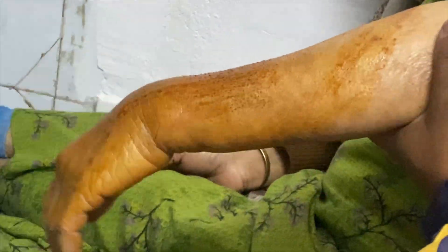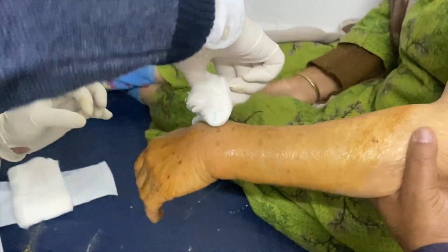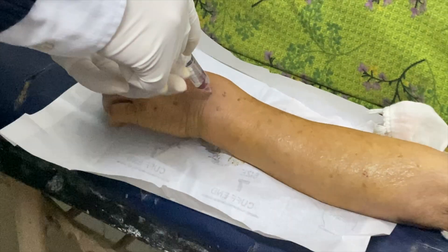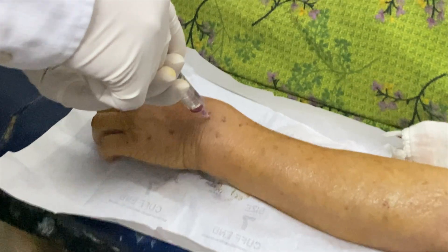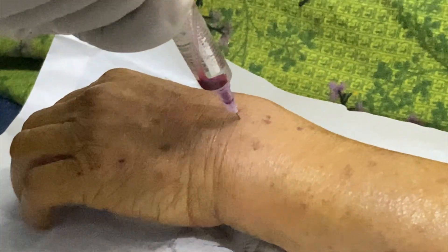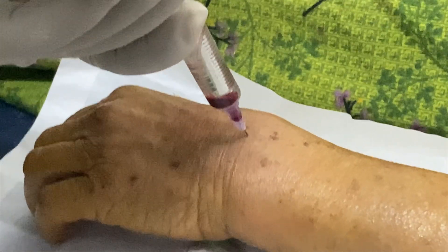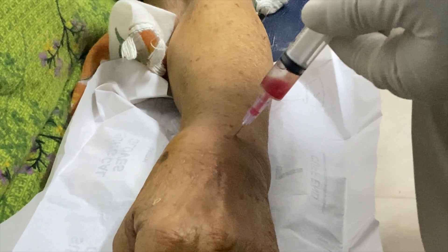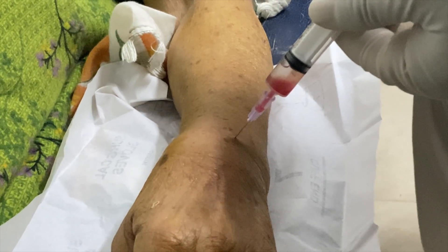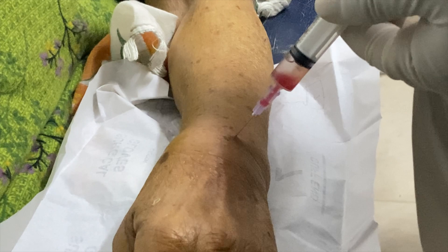The site is prepared with betadine solution and cleaned with spirit solution. Now I will give a hematoma block. Hematoma block is a very helpful procedure because it is virtually pain-free if given correctly. Try to keep your needle parallel to the fracture surface. Insert the needle at the palpable step and gently negotiate into the fracture. See the frank blood coming — just push 2% lignocaine into the fracture site.